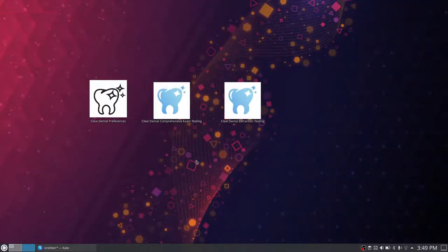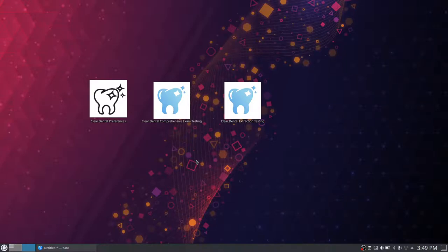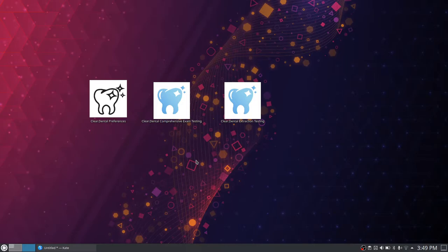That is it for now. There are still more modules that can't be shown at this moment, but they are actively being worked on. The Minimum Viable Product is still on track for August 1st of this year, and updates will be shown as they come along.